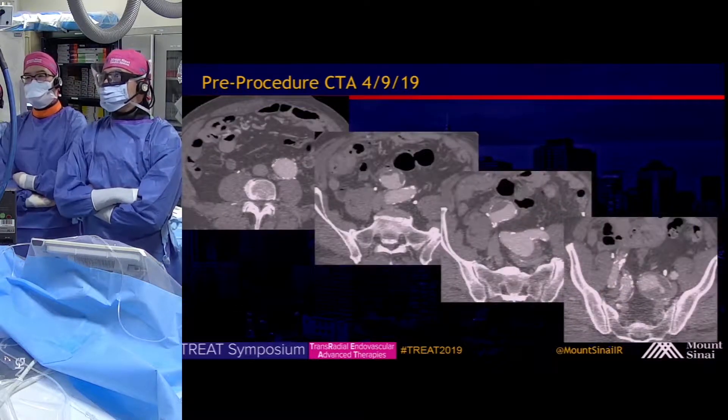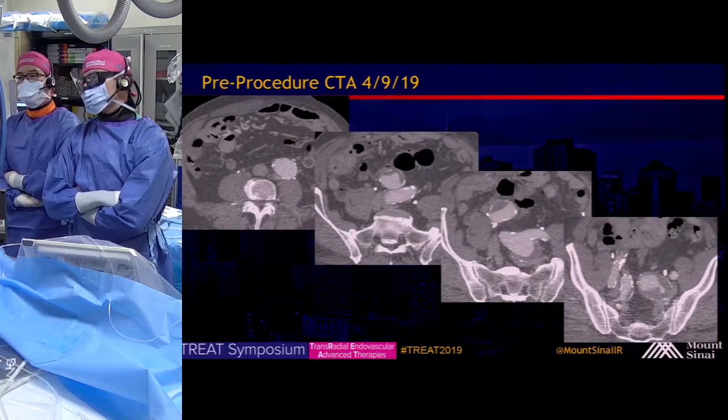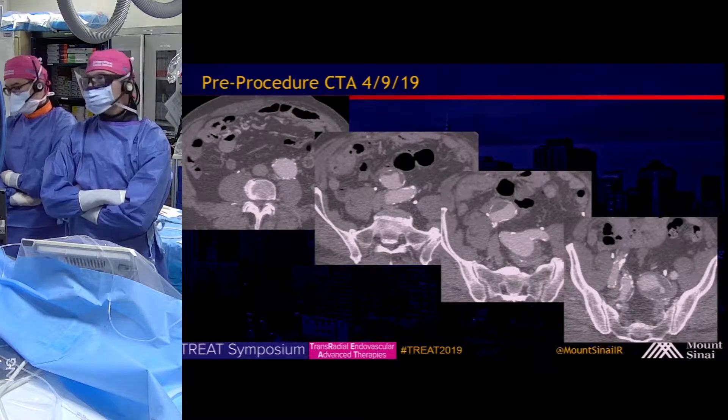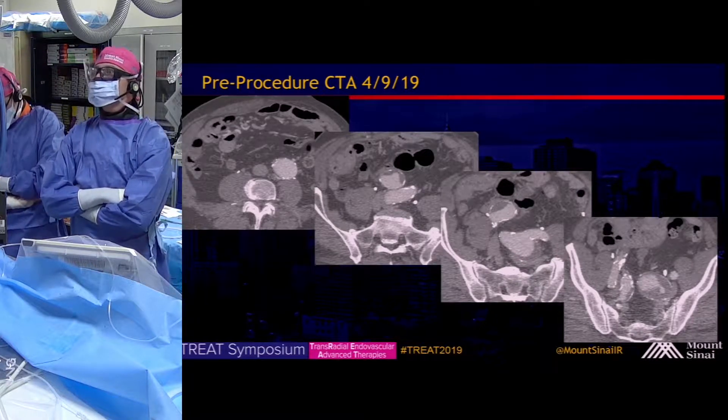These are representative images of the distal aorta and aneurysmal internal iliac artery.